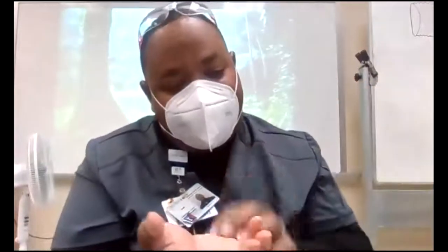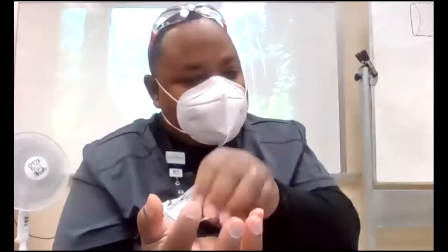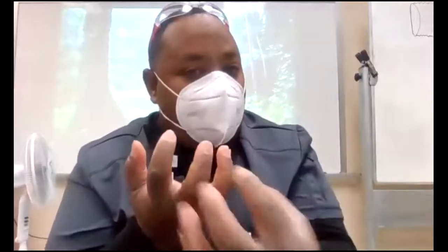So if I take some water and I just pour it on the disc, as soon as the water hits the disc, it turns into a mist. And the platter itself has little cones on the side, like my fingers. So the platter is spinning inside my hand. You drop the water in, or it's got this tube that sucks it in, and it comes out the bottom of the stick, hits that platter and mist. Shoot through these cones here, and inside of the container, and it directs it out to the spigot.